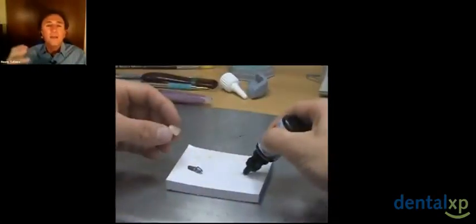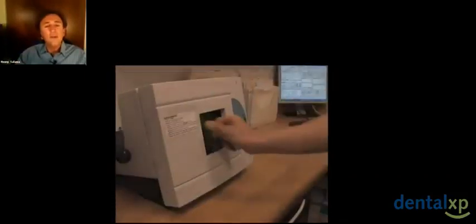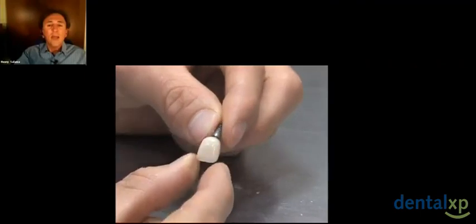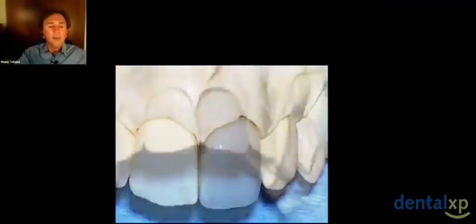Transfer copings, temporary abutments. So in this case, what you're seeing is actually the final abutment fabricated. A temporary is fabricated as well, and then we're able to have that ready at the time of implant placement.